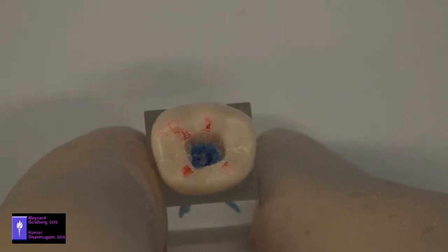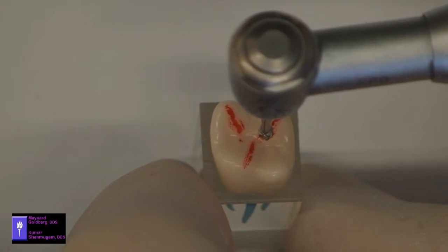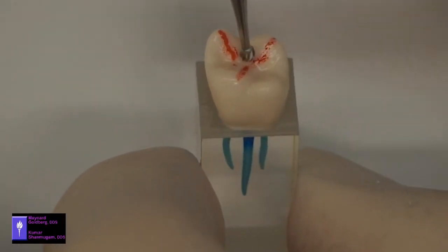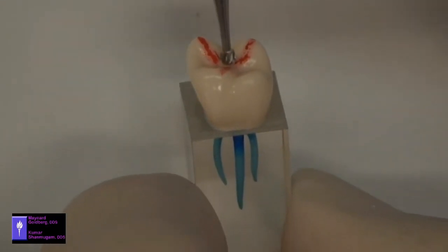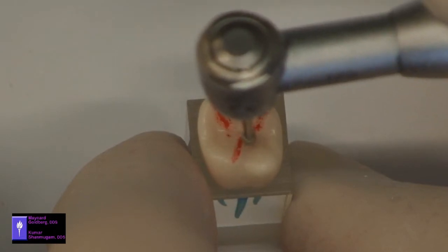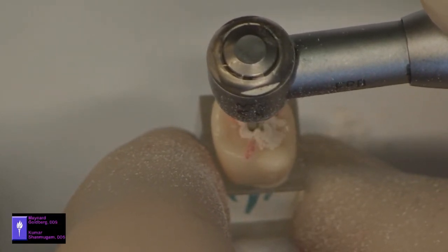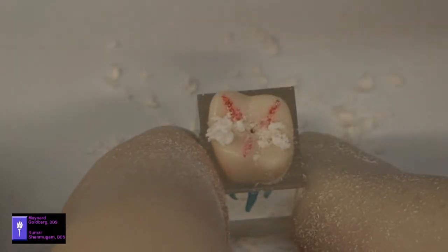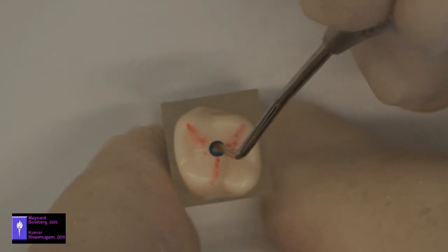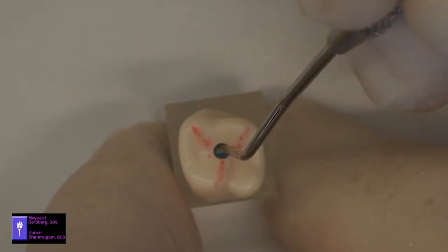Now we will proceed to the maxillary molar. For the maxillary molar, as with the mandibular molar, the burr is held in the long axis of the tooth in the central fossa, as so. Continuing with the slow speed handpiece, the burr positioned in the central fossa, we penetrate through the enamel, through the dentin, and into the chamber. We fell into the chamber. Putting the double-ended endodontic explorer in, we find a catch in the roof of the chamber. And we will now place our burr into that perforation and start the funneling process.